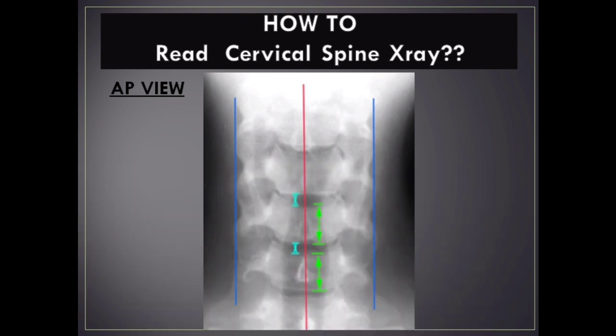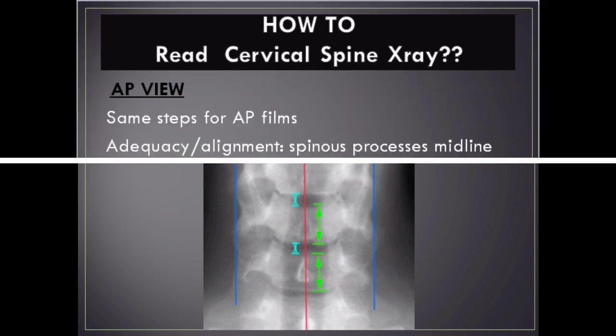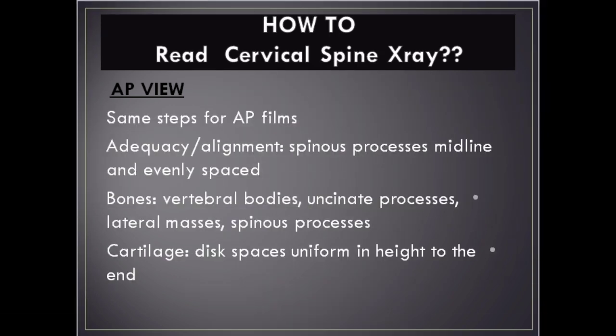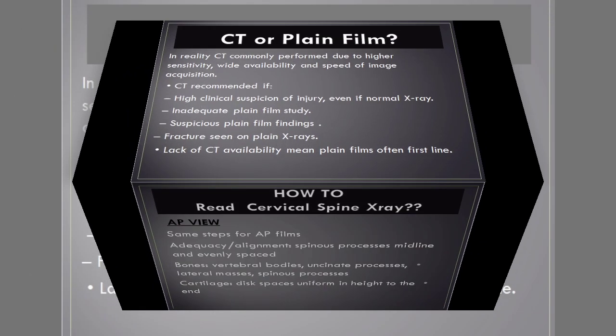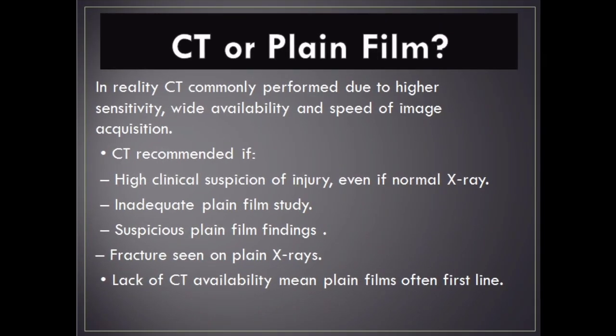Anteroposterior View: Apply the same steps to AP films. Check adequacy and alignment — spinous processes should be midline and evenly spaced. Assess vertebral bodies, uncovertebral (uninate) processes, lateral masses, and spinous processes. Disc spaces should be uniform in height.